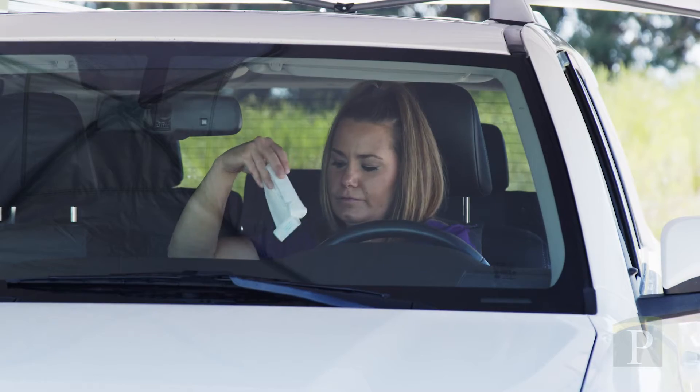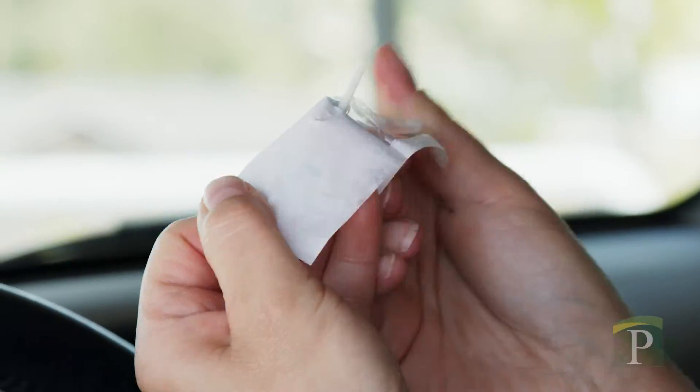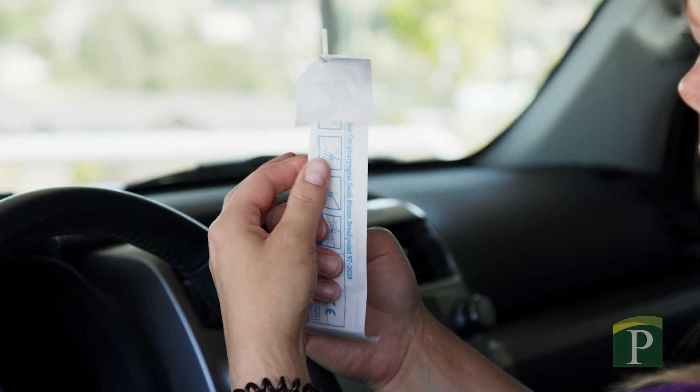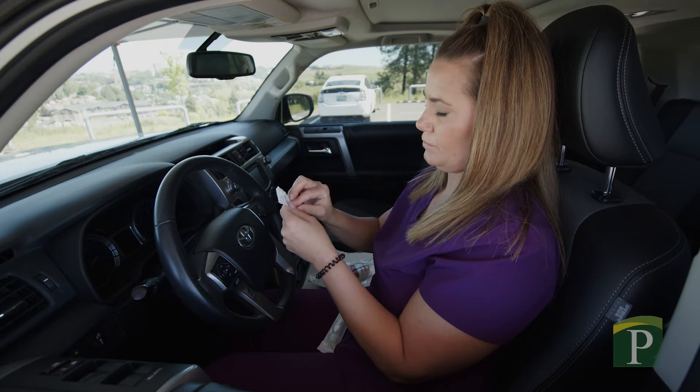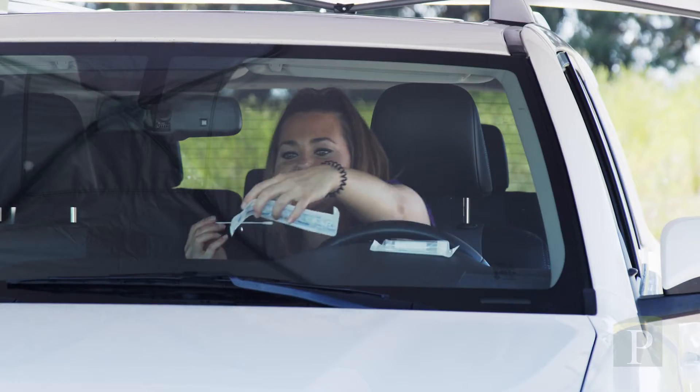Now it's time to take the test out of the package. Peel away the plastic around the cotton swab, but don't throw it away — you will need it later. Carefully remove the swab, making sure the tip doesn't come in contact with any other surfaces.